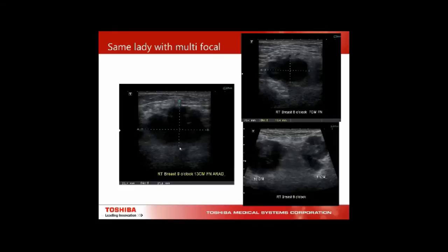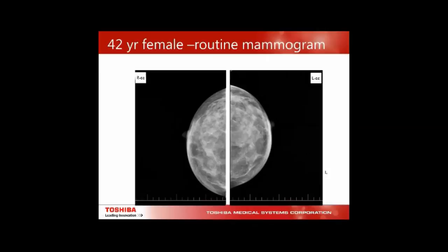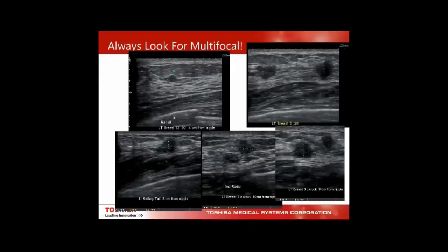Always make sure you see the chest wall. A lesion that looks non-penetrable may be a fibroadenoma on lowering the probe frequency. One patient showed multiple lesions invading up into the Cooper's ligaments — a form of branching pattern. This 42-year-old female came for routine mammogram screening. Starting at 12 o'clock there's a small lesion; at 2 o'clock two lesions; at 3 o'clock more lesions biting through fascial layers — this patient had at least six breast cancers within the same breast.